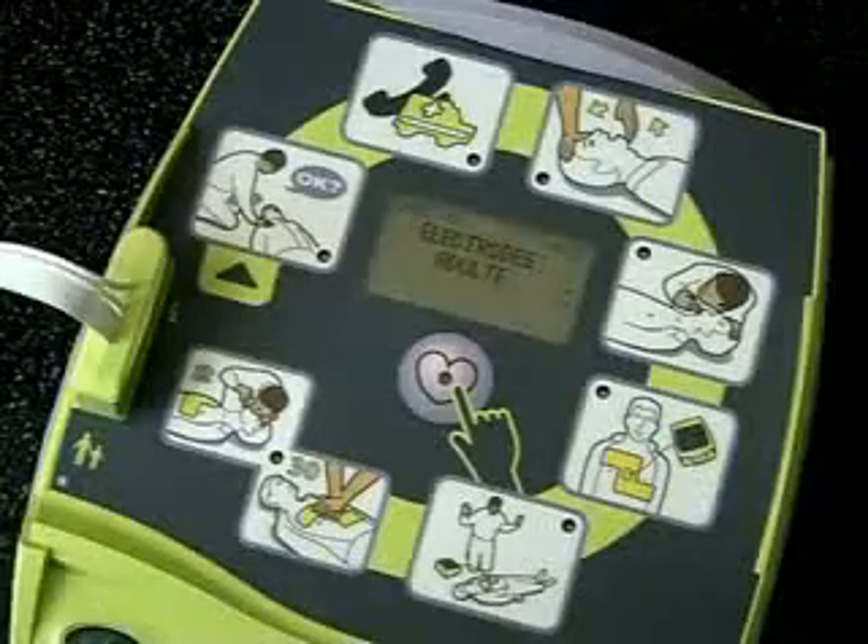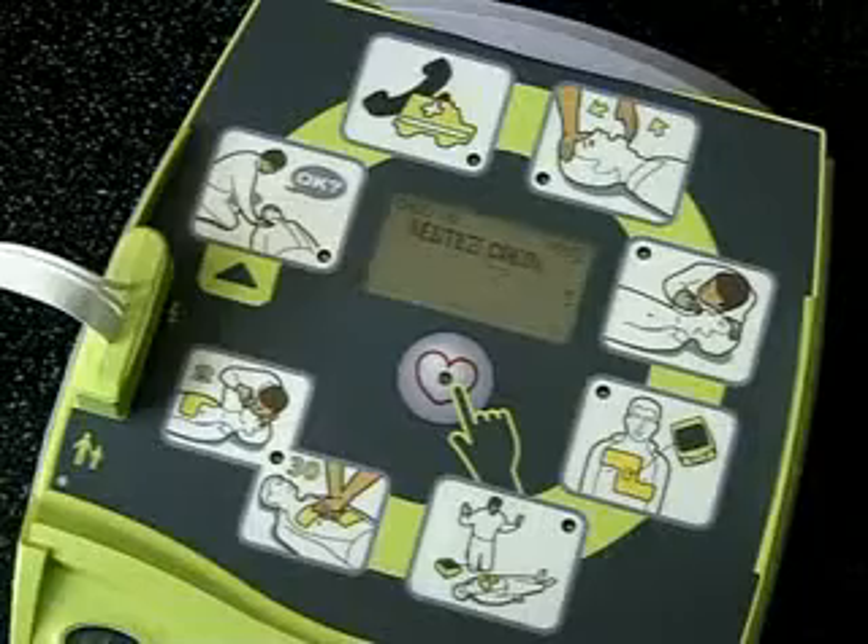Appareil prêt. Électrode adulte. Restez calme.